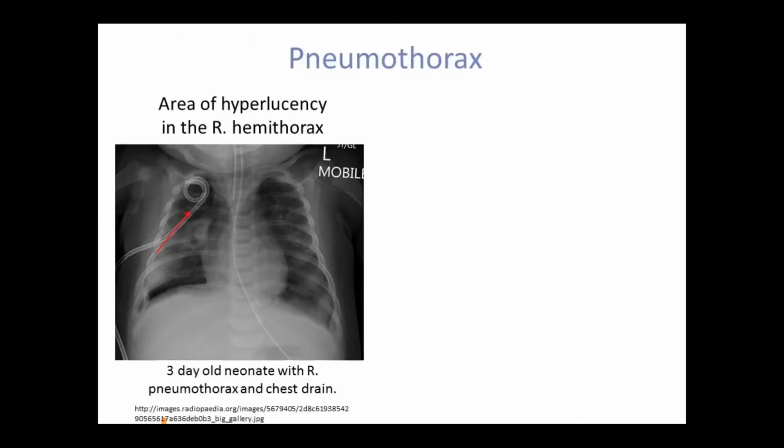Our 3-day-old patient has a pneumothorax. A pneumothorax can occur as a result of trauma injury to the chest, as a complication of a long-standing lung condition, or as a spontaneous idiopathic entity. Tall and thin adolescent males are at a higher risk of developing spontaneous pneumothoraces. Pneumothoraces in neonates are often idiopathic in nature, but are often associated with complications of ventilator therapy.